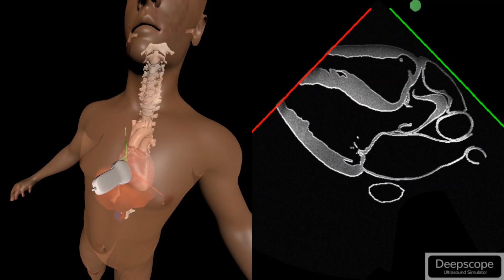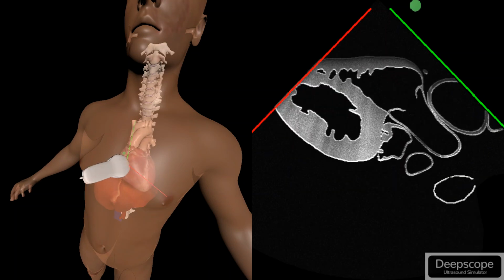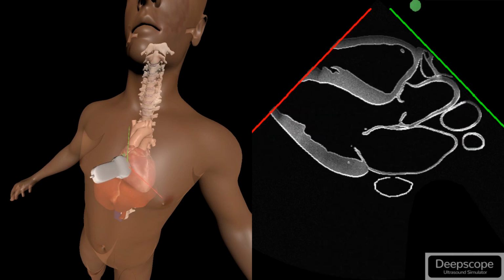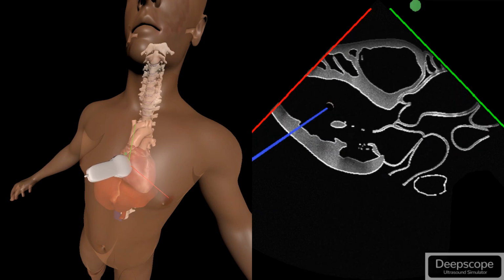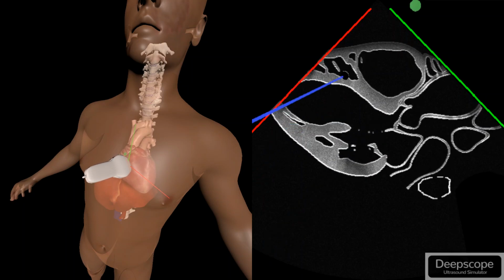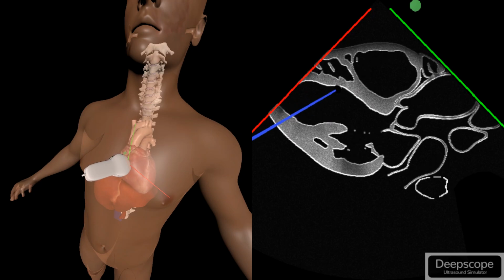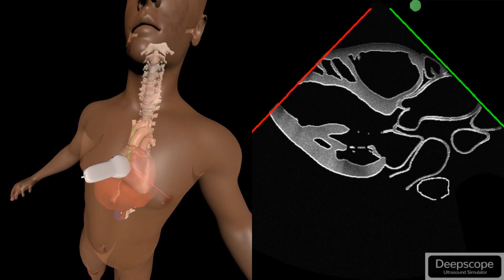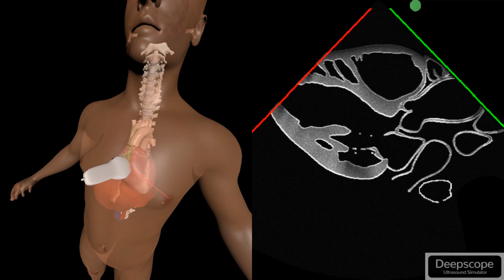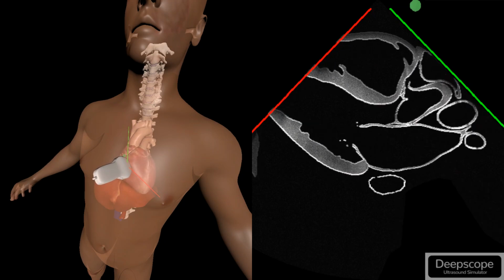Similarly, what can happen if we tilt off axis, and by tilting we're going along the short axis of the probe as such, and if we tilt off axis enough, we start obtaining the papillary muscles of the mitral valve leaflet, and notice how much smaller the cavity is. In this case, even though we are parallel to the long axis of the heart, we are not cutting through the center of the heart. So the correct motion here is going to be to tilt the probe until the papillary muscles are gone.